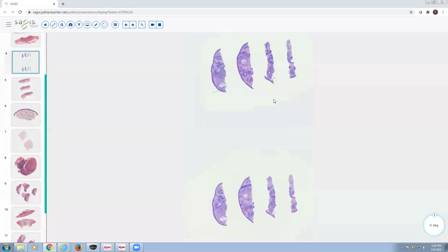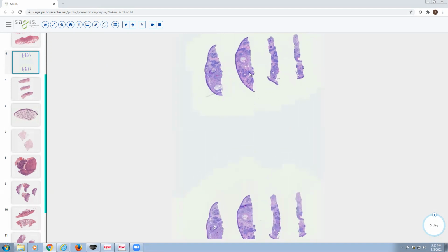And when I say small, I'm usually talking about a couple of millimeters, 2 or 3 millimeters, 4 millimeters, the type of thing that clinically you might consider a diagnosis of sebaceous hyperplasia or a fibrous papule. With a trichoblastoma, you're usually thinking more along the lines of a cyst or a larger tumor, something like the size of a grape. So trichoepithelioma is smaller than trichoblastoma.